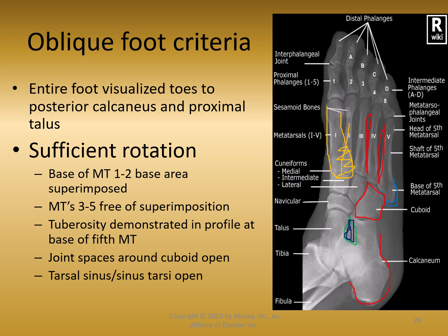tarsi. Also in this image, we can see the navicular nice and pretty. Got the navicular here, very well demonstrated, right, where it articulates there at the talus. Here, that's the talus, and this is the calcaneus. All right, and then of course, at least an inch of the distal tib fib.